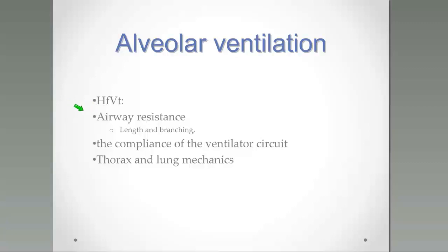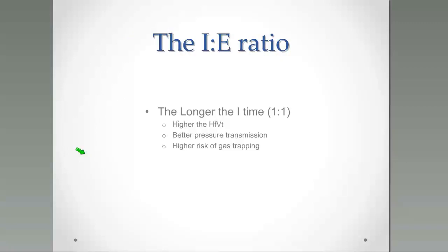Also the compliance of the ventilator circuit and the thorax and lung mechanics. So it's important also to remember that even if we have a certain tidal volume during high frequency ventilation, if the lung or thorax mechanics change along the day, probably the PCO2 is going to be changed. So keep in mind this, because this is going to be important to the end of the talk, when we are going to review one of the important things about the handling of this kind of ventilation.